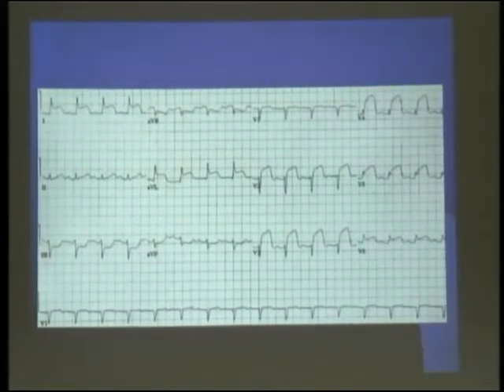You don't want to say extensive anterior, that is the problem with you people. Never diagnose ECG when you are reading. When you are reading ECG, just read the things that are there. So tell me what's there in terms of ST elevation and depression.